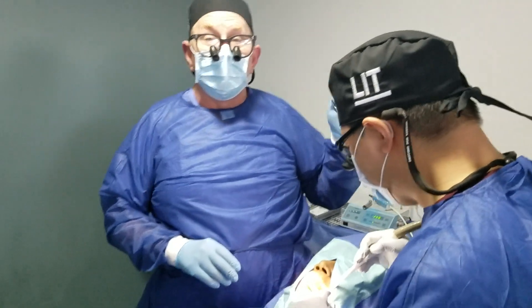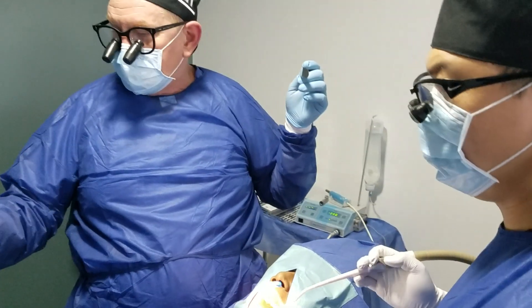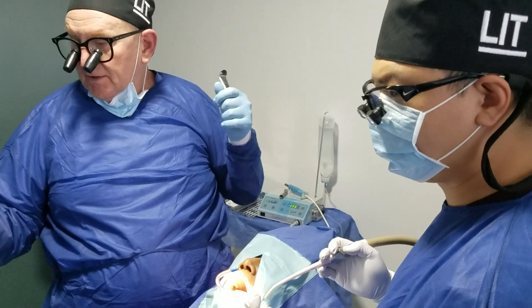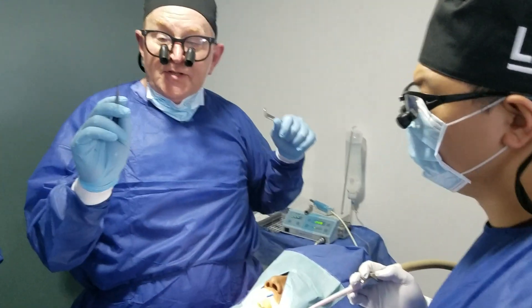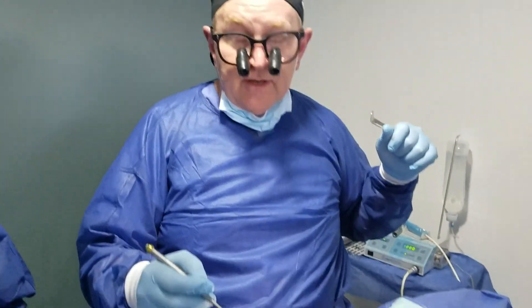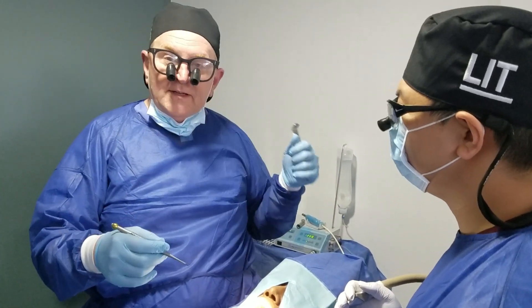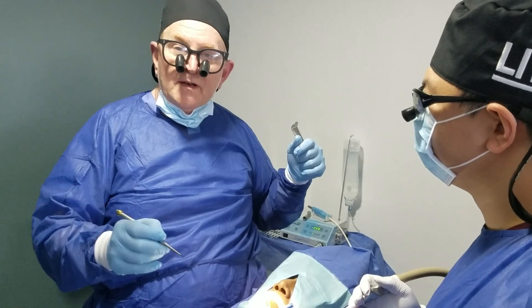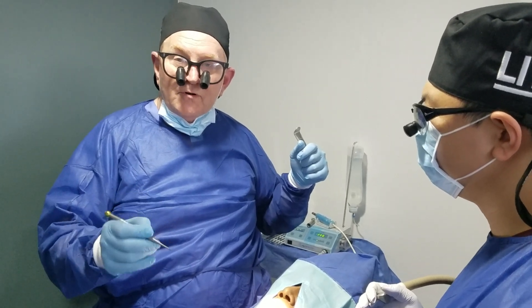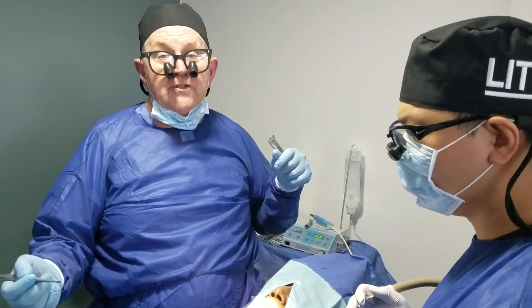Doctor, can you show us the approximator you used and tell us your take on it, your experience with it? The spade approximator I used — to engage the mesial of that tooth, get down the periodontal ligament — not only did it get down into it, but it started luxating the tooth. I started to get some immediate movement using that with some firm controlled pressure, which made it very easy to luxate the tooth out with force on it.